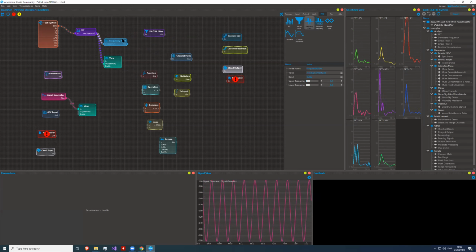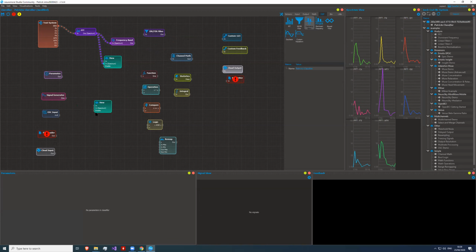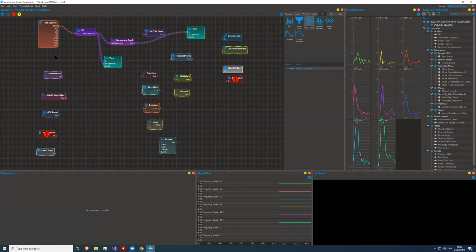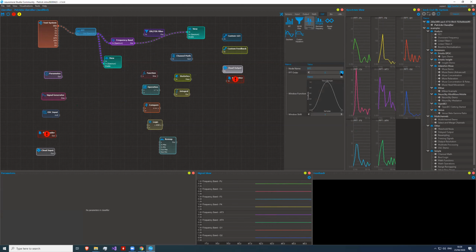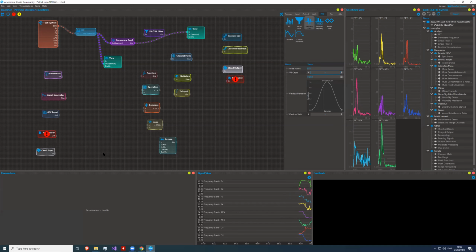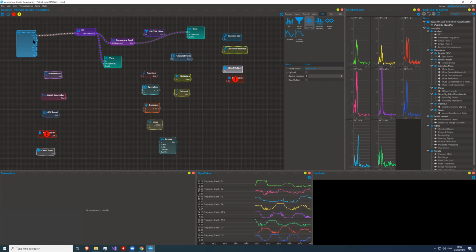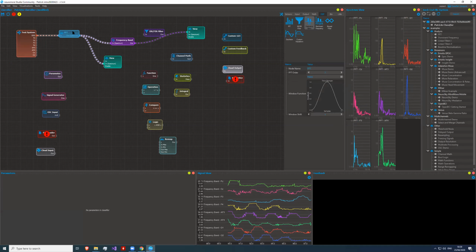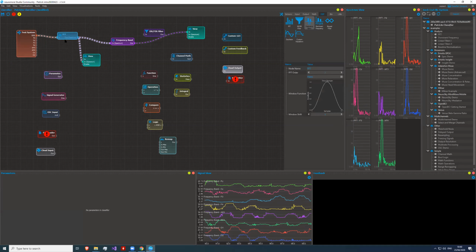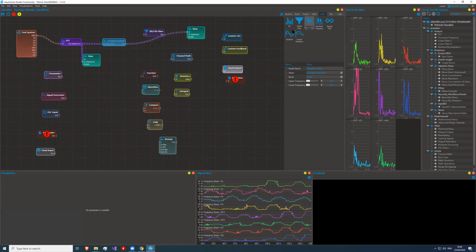So now we can feed it in here to the frequency band, for instance. So let's remove that connection. Now we can look at, how does it look now? Now we have all the frequency bands extracted. So yeah, if that FFT order is nicer. Yeah, the test system is just randomly generated data, so it's not my brain currently that goes bananas. Just for the simplicity of showcasing that. So now we have frequency output, for instance.